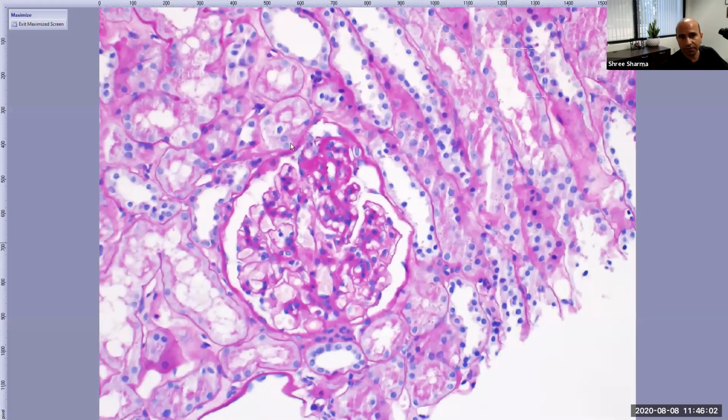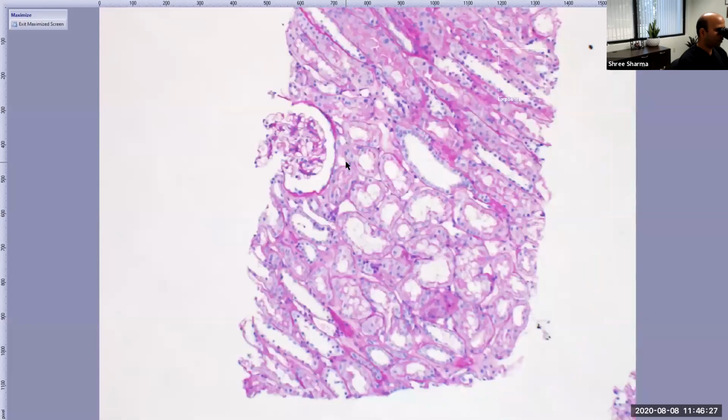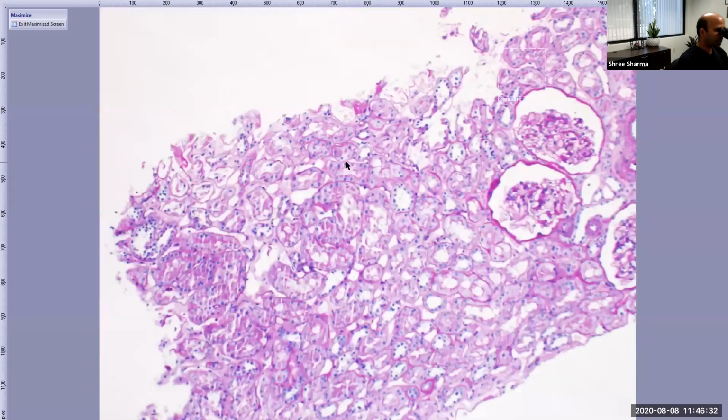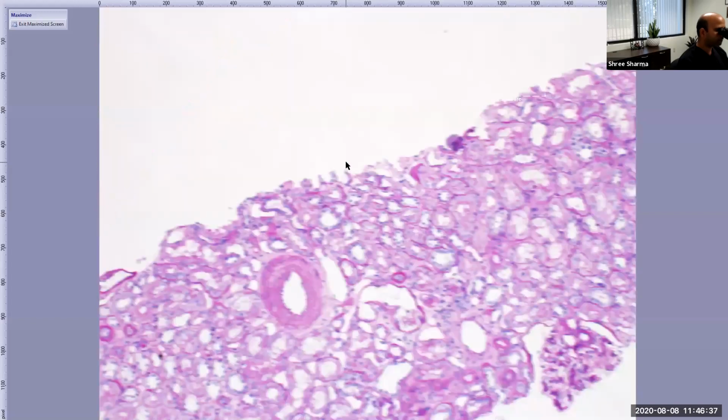You're looking at a lesion of segmental sclerosis. And now, to classify this into tip, you want to show the relationship of this lesion to the tubular pole. And as we know, you might not end up seeing that relationship on all the sections or all the levels, but you want to prove that. And this is the hilar pole. This lesion is far away from that. This is at the tubular pole. So you end up looking around the glom and you try to find out where is that relationship. So once you show that relationship, you classify that particular lesion as a tip variant FSGS, okay?